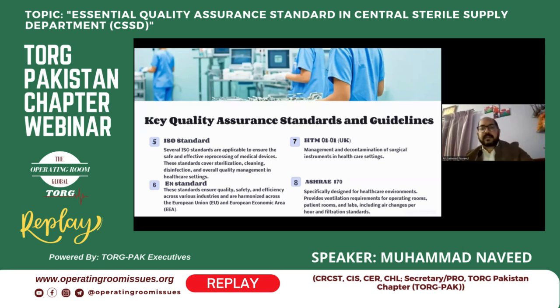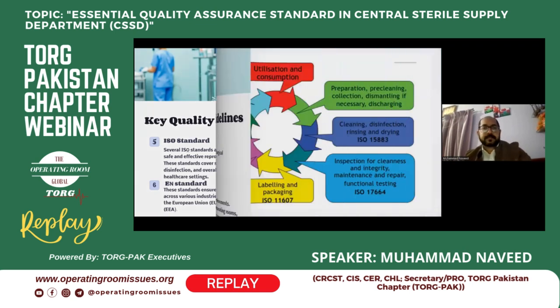Specifically, that standard is designed for environmental cleaning and patient safety. They are telling about ventilation requirements in operating rooms, patient rooms, and labs, including air exchanges. They will tell us how many air exchanges we need in CSSD and how much we have to maintain the temperature and the humidity.